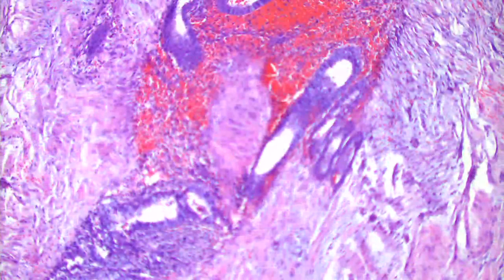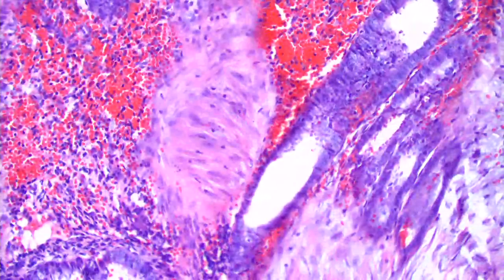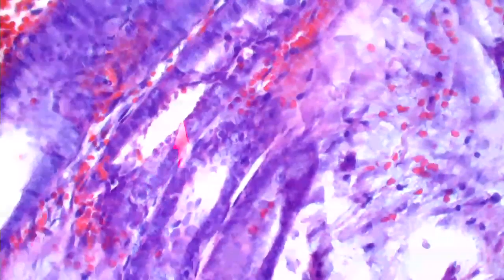Groin. Often if there's been a prior surgery, and there is a scar in the background here, so this may have been at the cesarean section site, a C-section or something like that, that developed there. Some people think this may be some kind of implantation process, but it's probably more like a metaplasia in some way. It's probably got some cilia on the surface here, most likely, I would imagine. So this is cutaneous endometriosis.